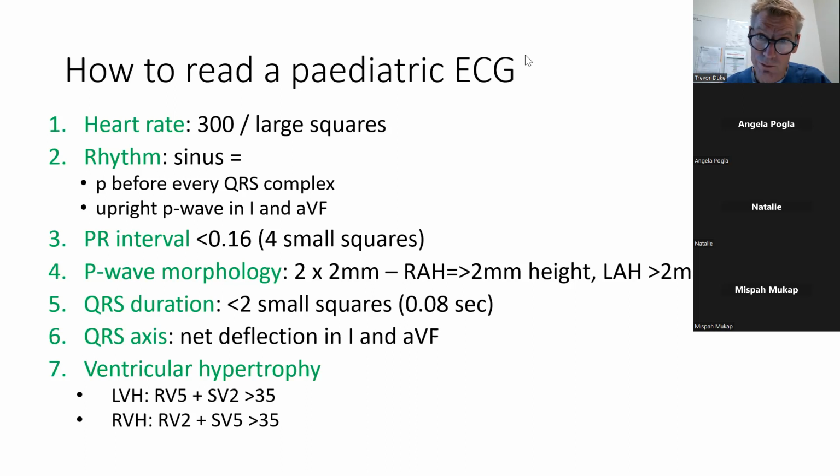So I think we might stop there. That's a lot of things we've talked about today. If you practice by looking at some ECGs and trying to read them and write down all those things, I think that's the way to learn how to read a pediatric ECG.